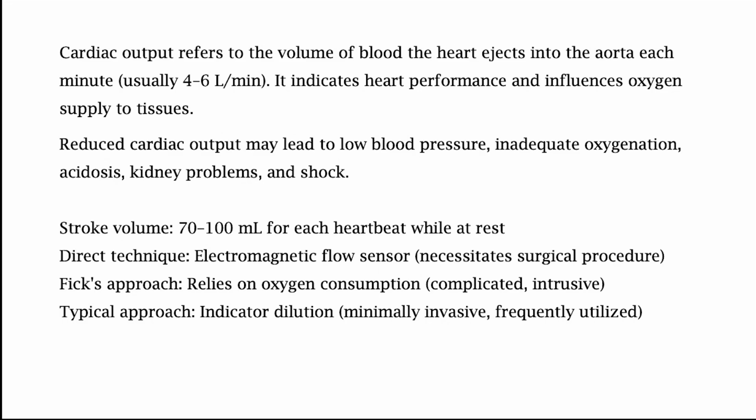Okay. So the stroke volume is about 70 to 100 ml for one heartbeat while at rest. By the way, this will change as you are exercising. So there are many ways in which I can measure. Of course, the flow sensors.